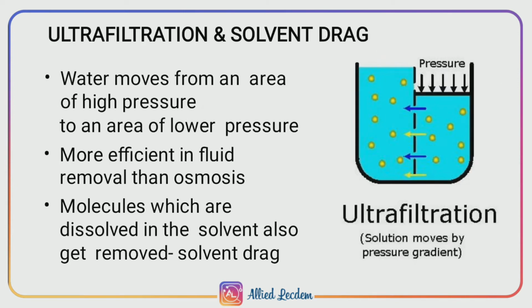Ultrafiltration and solvent drag: water moves from an area of higher pressure to an area of lower pressure. It is more efficient in fluid removal than osmosis. Molecules which are dissolved in the solvent also get removed in solvent drag.